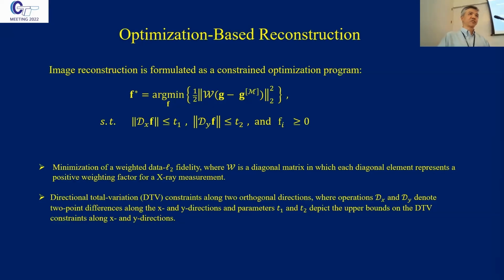Of course, this is a discrete model where the matrix size is going to be sizable, so a natural approach is optimization. You set up a surrogate metric as your objective function, and if you can minimize or maximize it, that's your solution. Whether it's useful, or whether it solves the inverse problem, we worry about later. Everybody does this, or maybe deep learning, but there is also some kind of loss function and training involved. Anyway, we're dealing with a discrete model and using an optimization approach.